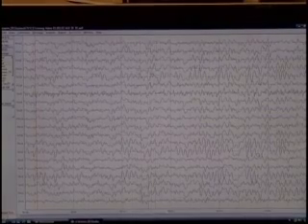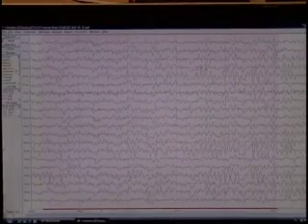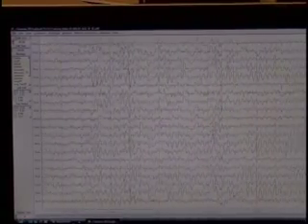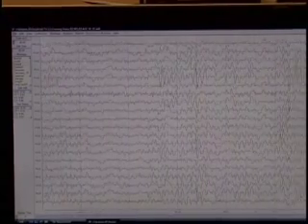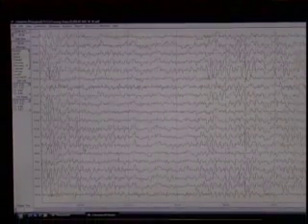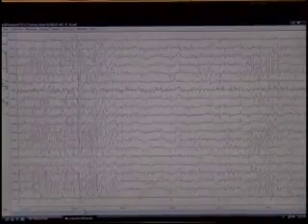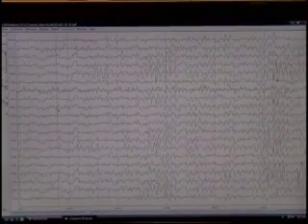I take my left mouse button and sweep out a nice area — I've swept out about four seconds — and let it turn pink, showing that it's selected. We then move along to another part of the recording, looking for another part that we feel is representative without trying to avoid things in particular. I'll grab this chunk here, then move along a little further, inspecting it and looking for things that make sense.